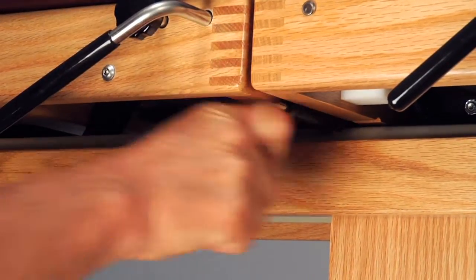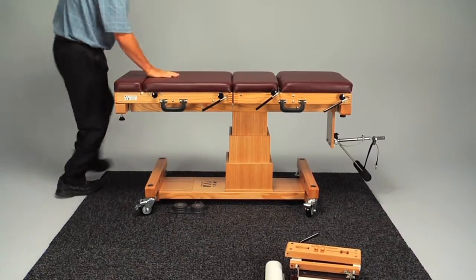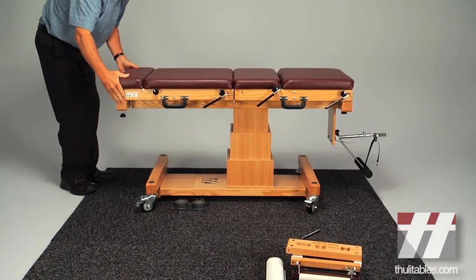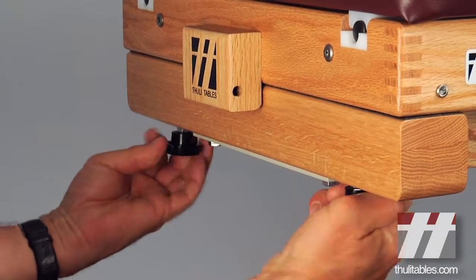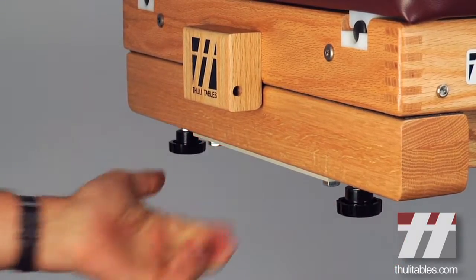Attach the back half of the table to the base as you did the front half, replacing the hinge pins and engaging the knobs. Now your portable table is securely mounted to the conversion base.